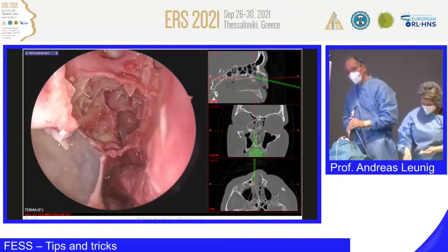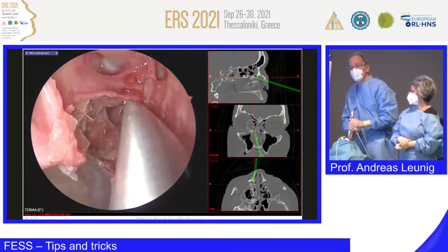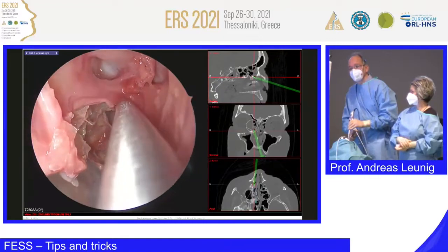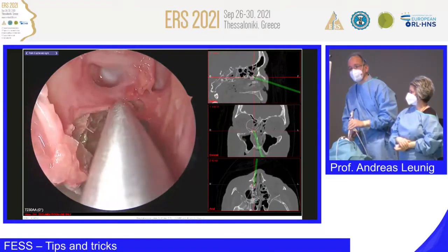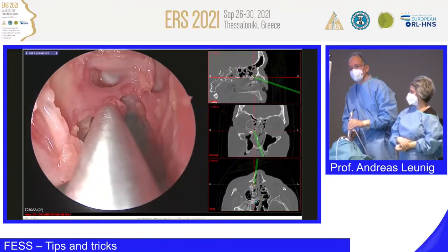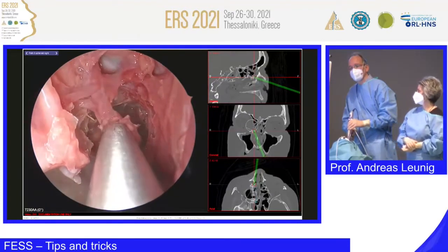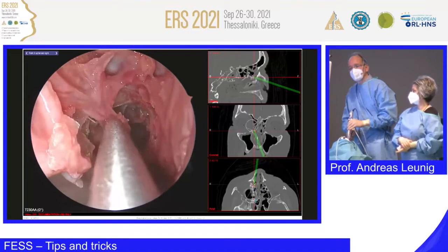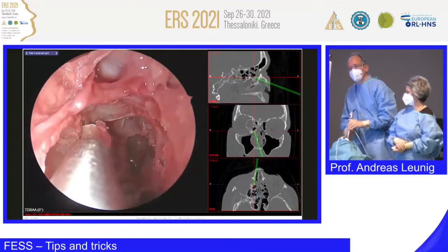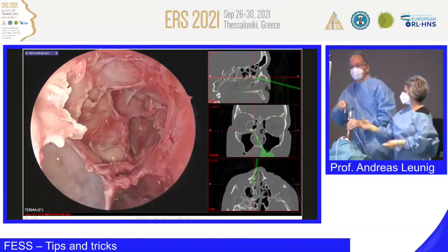When you go in with your endoscope, you should not touch the hairs in the vestibulum nasi, because this can be annoying. You always get debris on your endoscope and then you have to come back again, take a compress or gauze and dry the entrance. Oh, this is not what you should do. Tearing mucosa, that's bad. Trying to fold it back. But for demonstration's sake, it's allowed to make this stripping of mucosa.